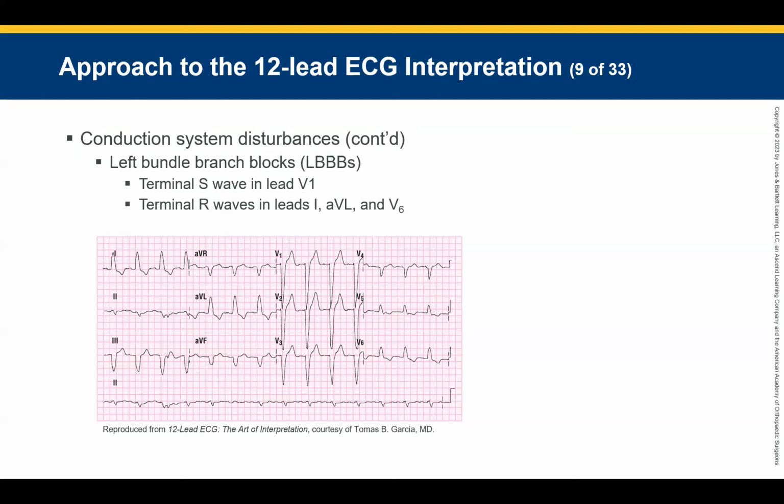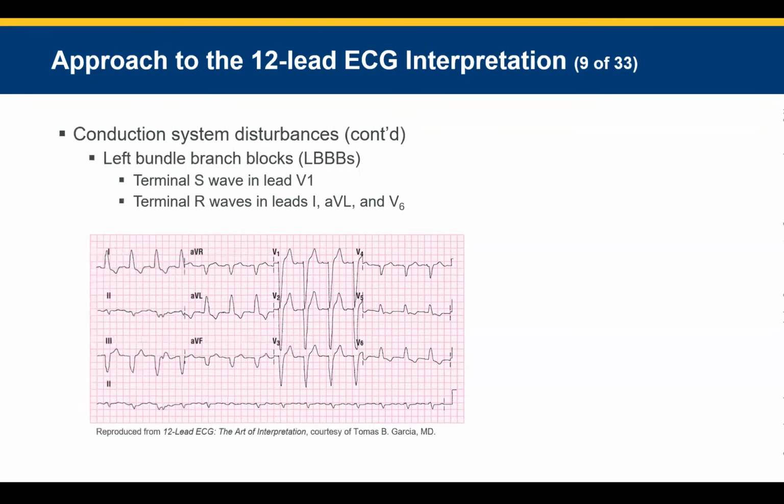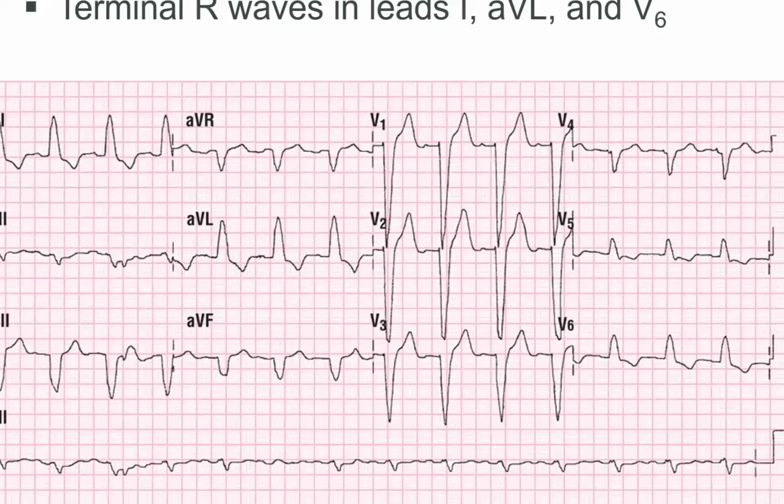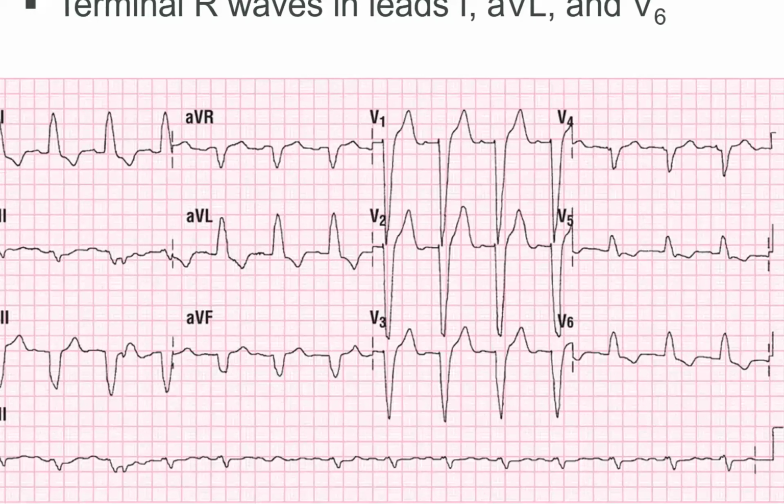Looks like there might be one in 4. They need to be identifiable. And I'm struggling to say that this is a great example, but if we look at lead 1 here, I see a bump there and a bump there and a bump there, kind of the same place. We got wide, nasty beats here, so it's hard to see exactly what we're dealing with.